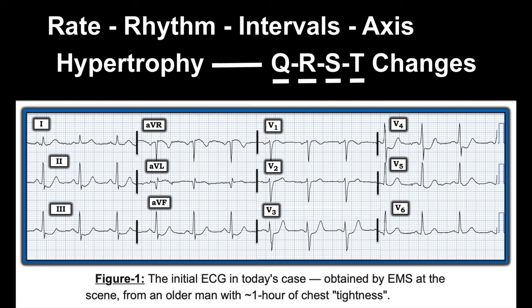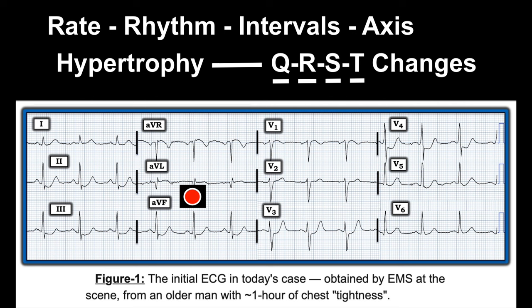The QTc does not appear significantly greater than half the R-to-R interval — probably fine. For axis: upright in lead I, more upright in AVF, so approximately plus 60 to plus 70 degrees — a normal axis. For chamber enlargement: the number 35 is the key criterion — deepest S in V1 or V2 plus tallest R in V5 or V6 — not more than 35, so no chamber enlargement.